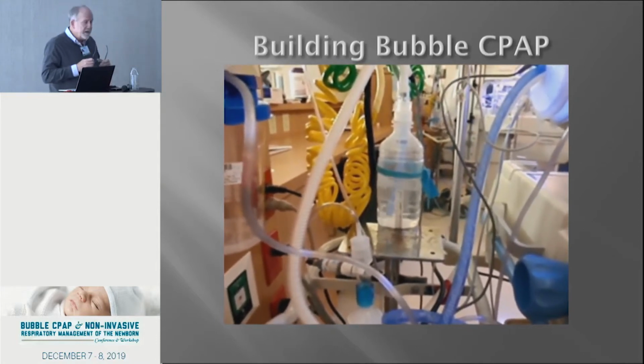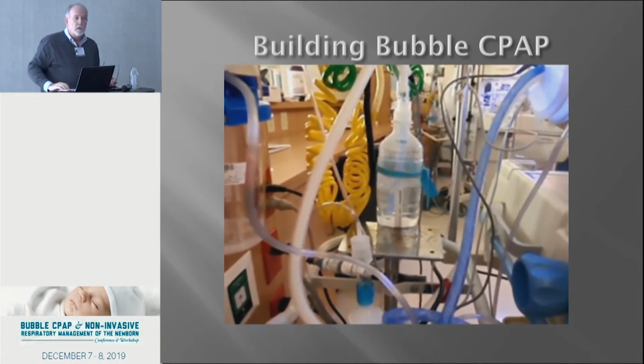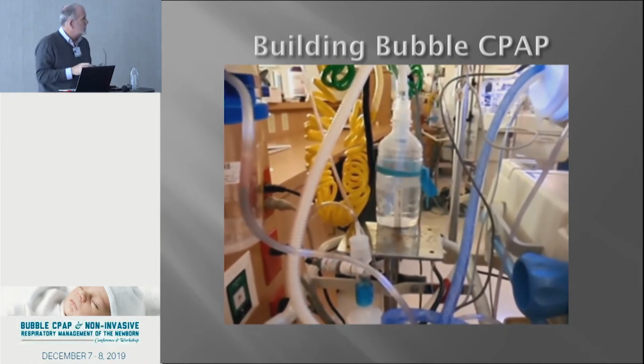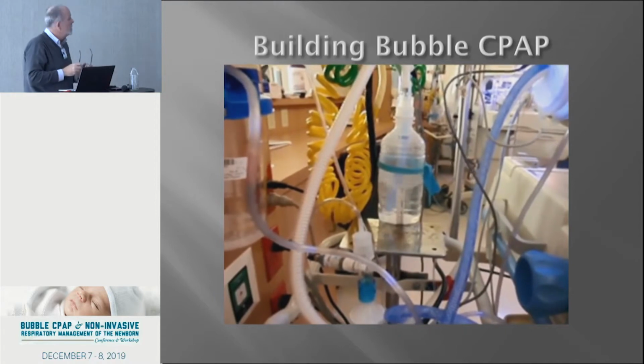When you don't see that vigorous bubbling, and especially in larger babies, you will see the actual column in that blue tube inside the water there doing this. It's just not quite coming out. So there's still a certain amount of CPAP being delivered. You can see the inspiratory effort moving that column, okay?